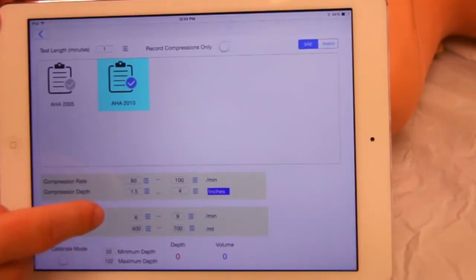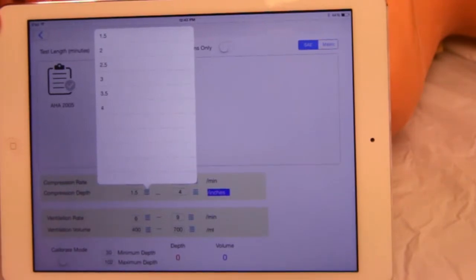For this example, we will have minimum depth set to 1.5 inches.